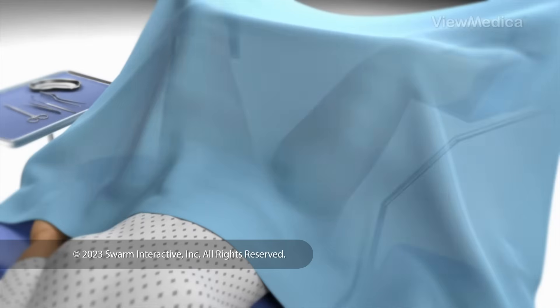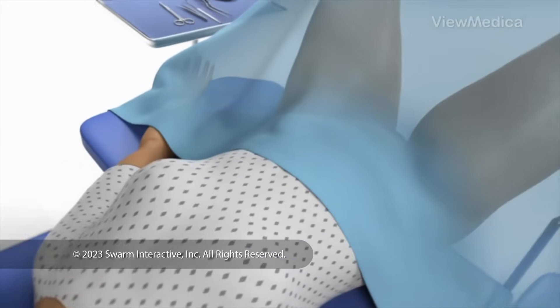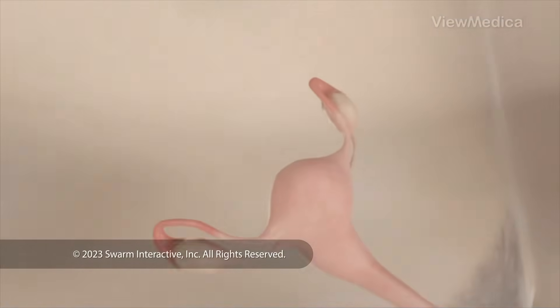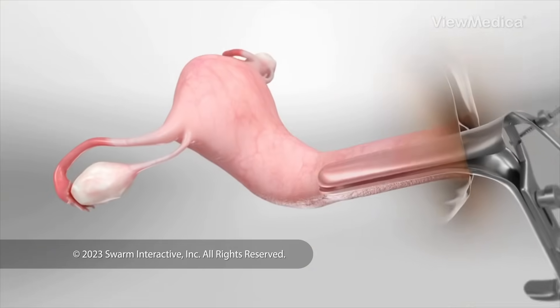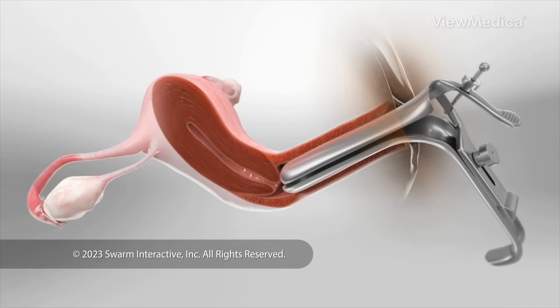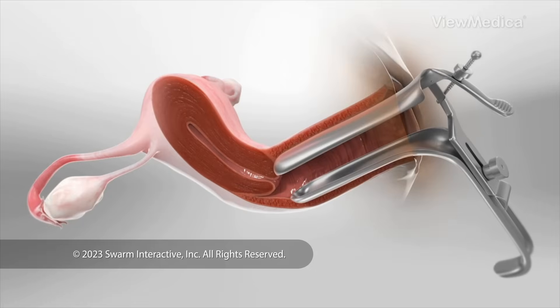To begin, you lie on an exam table that supports your legs and feet. We may give you medicine to get you relaxed and numb. We carefully place a device called a speculum into your vagina. The speculum holds your vagina open so we can reach your cervix.